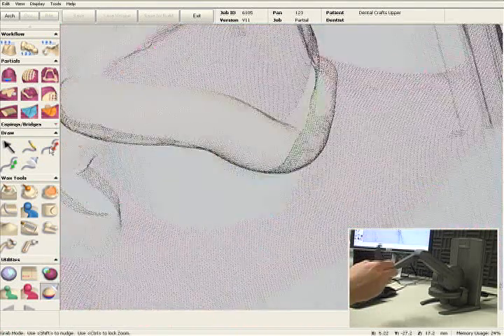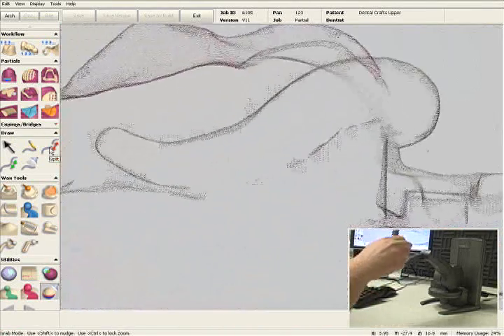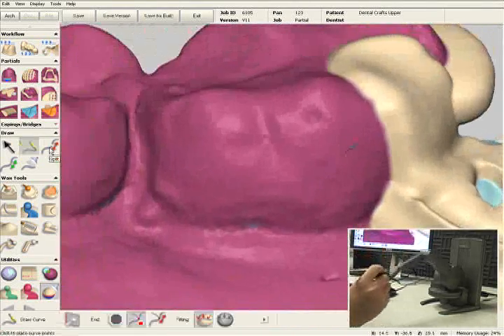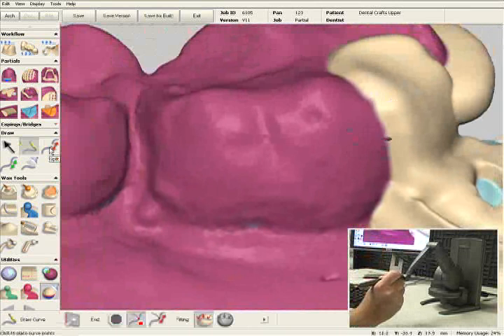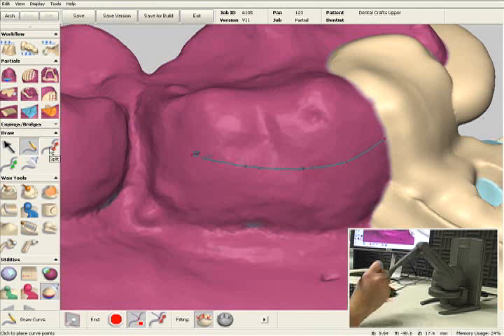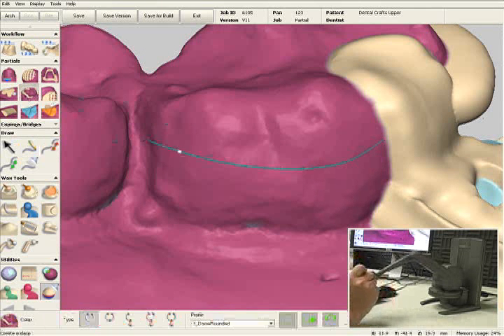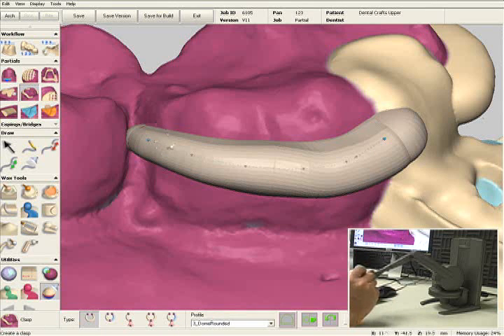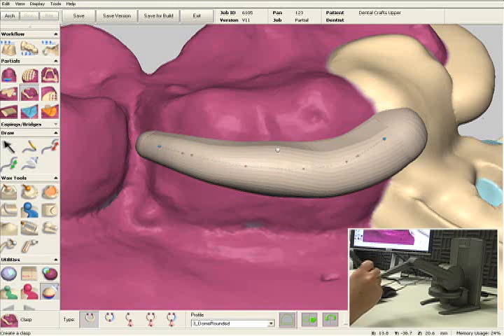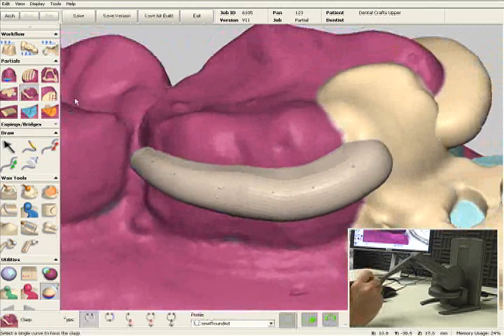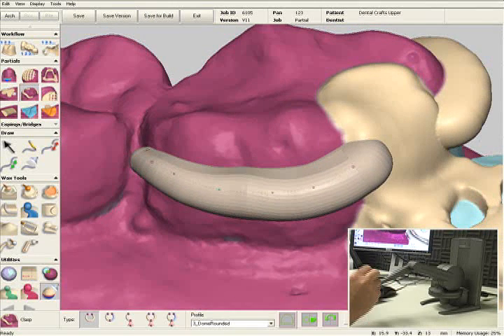I'll select the pencil tool again and draw another line on the lingual of the molar. I'll select the clasp tool and click on the line. I'm going to take the tip of this clasp and move it a little more mesial to make it a little shorter, then click apply and add the clasp to digital wax.